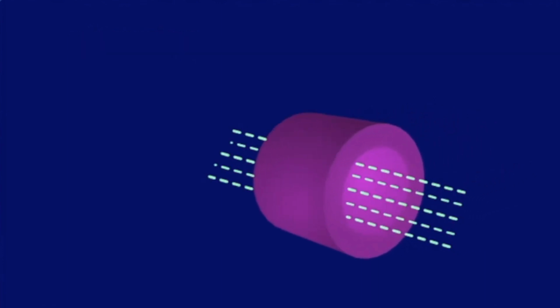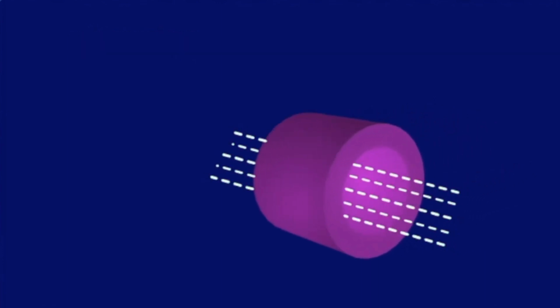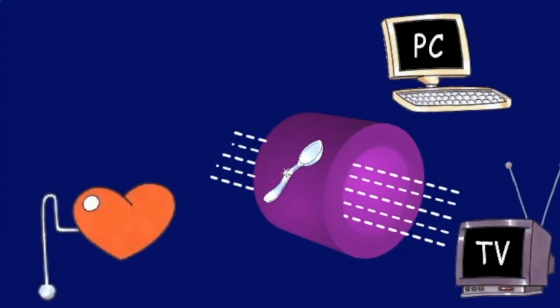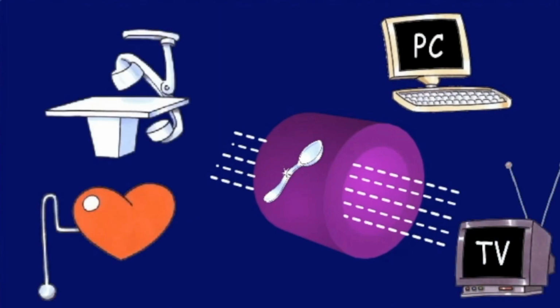The large static magnetic field of an MRI system requires special facilities for the unit. It extends outside of the imager and can attract metallic objects and influence mechanical and electrical devices like computers, monitors, pacemakers, and X-ray units.